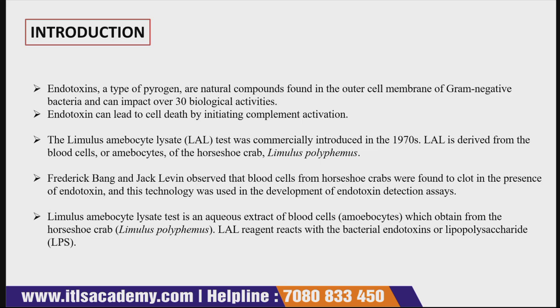So the Limulus Amoebocyte Lysate test is an aqueous extract of blood cells, that is amoebocytes, which is obtained from a horseshoe crab, that is known as Limulus polyphemus. LAL reagent reacts with the bacterial endotoxins, or you can say lipopolysaccharide, that is LPS.